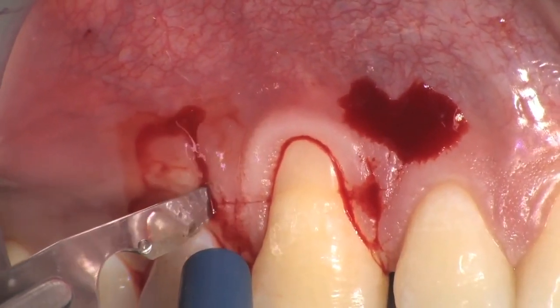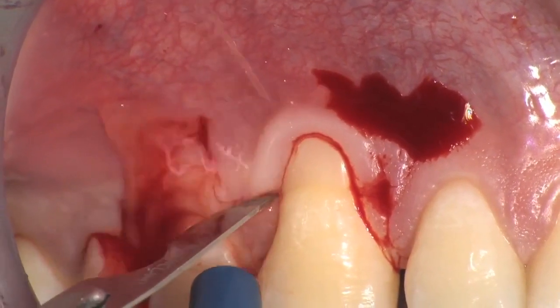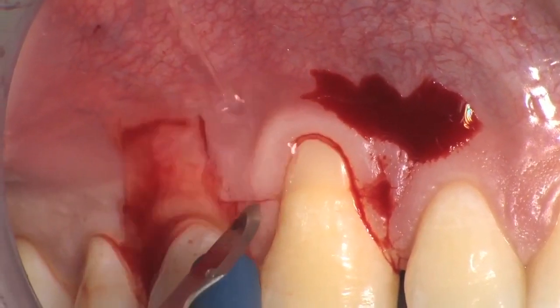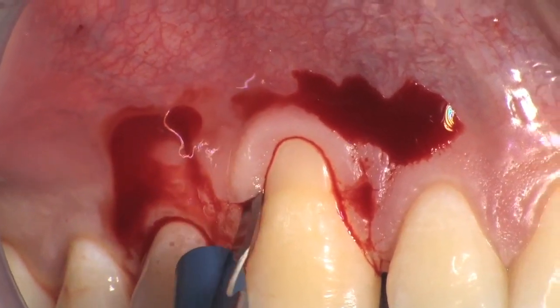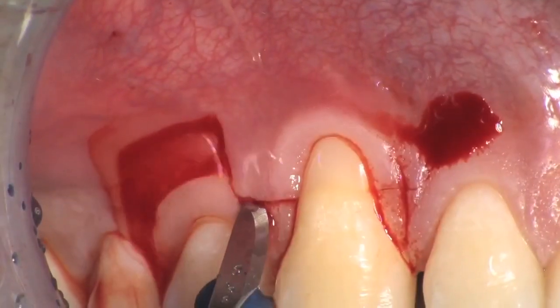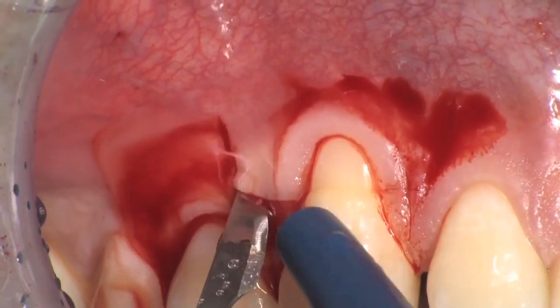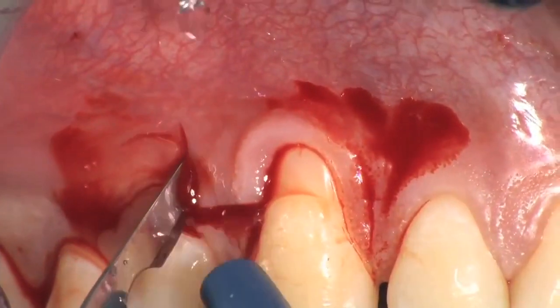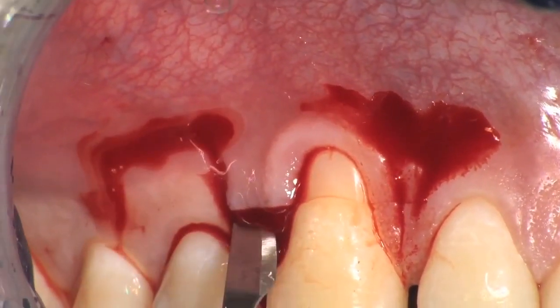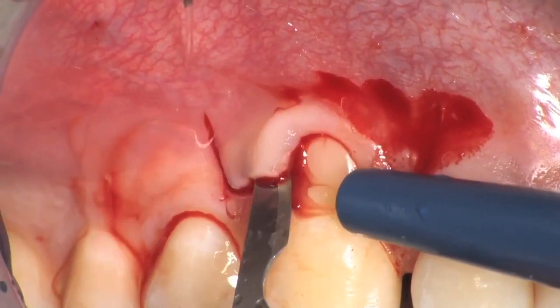The next step is to elevate the surgical papillae to a split thickness. To do this, one needs to follow the bleeding line and, making a very beveled incision, elevate the mesial and distal corners of each trapezoidal papilla. Once both corners have been elevated, it is much easier to keep the blade blind, parallel to the soft tissue, and give each surgical papilla a uniform thickness from the most coronal to the most apical extension.